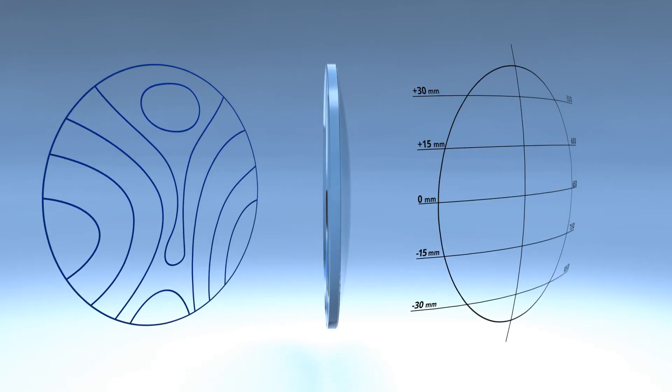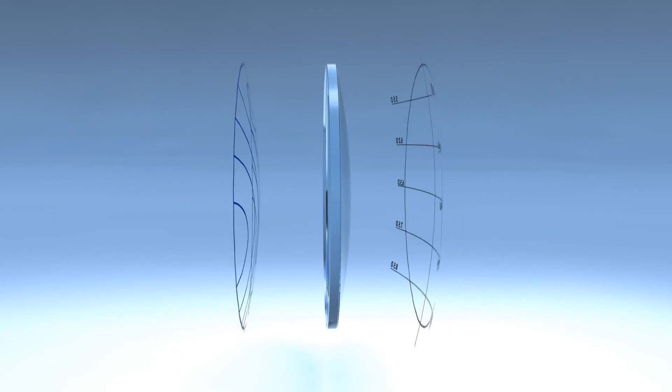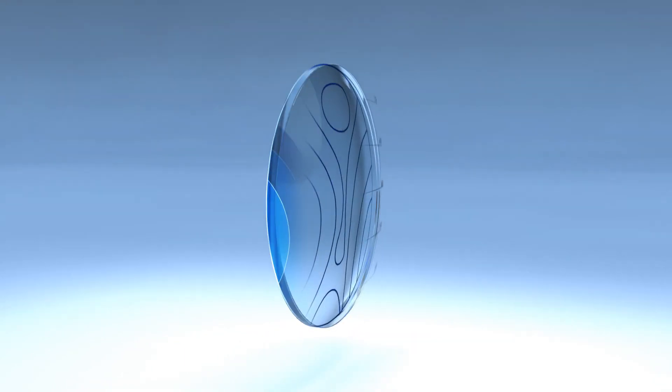The combination of curves on both sides of the lens creates the finished camber progressive lens.